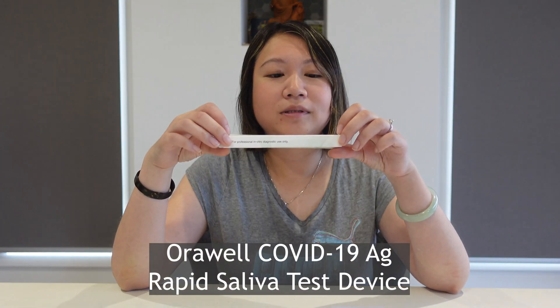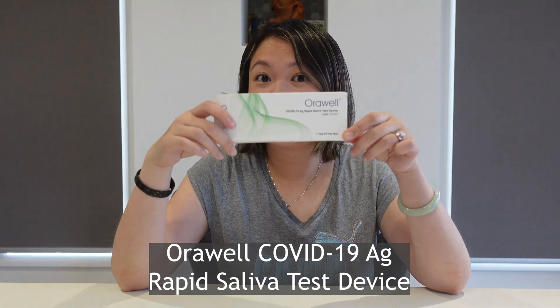Hi everyone! Today I will be showing you another rapid antigen kit. This one is by Orawell. It's actually a saliva kit. Let's try it!